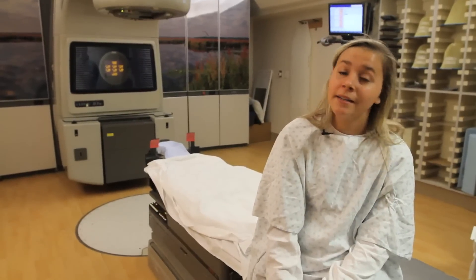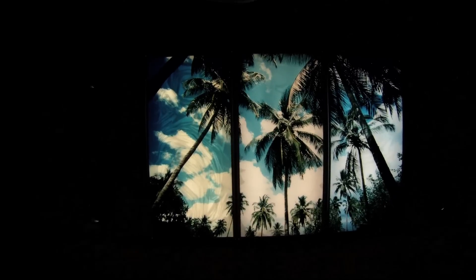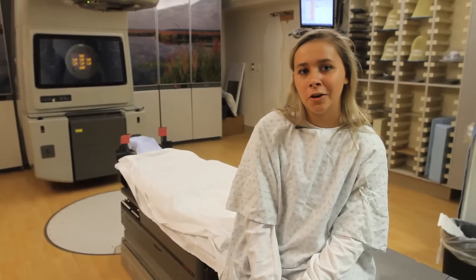When I opened my eyes, I liked the view up there and all the lights. When the mask was on me, I didn't feel a thing. I could breathe. It was soft and comfortable. It didn't hurt at all.